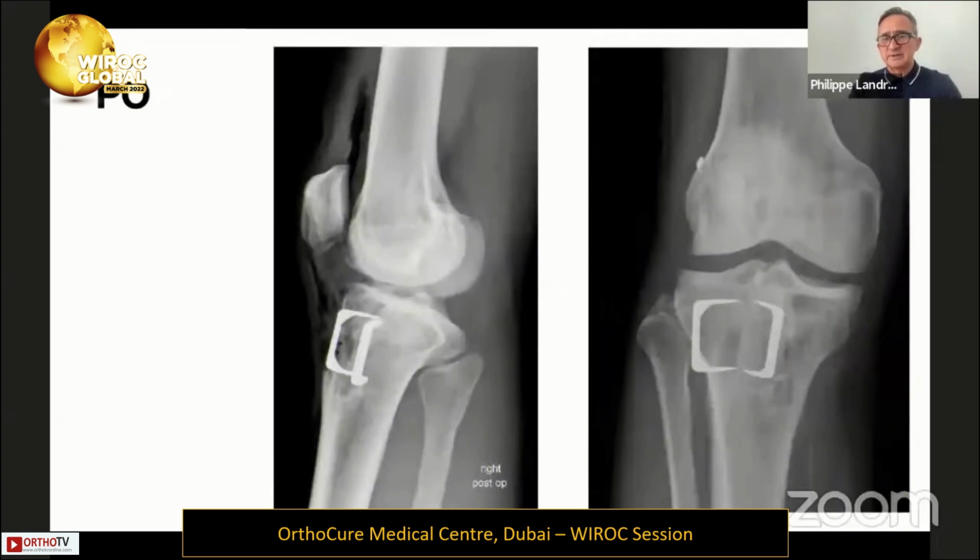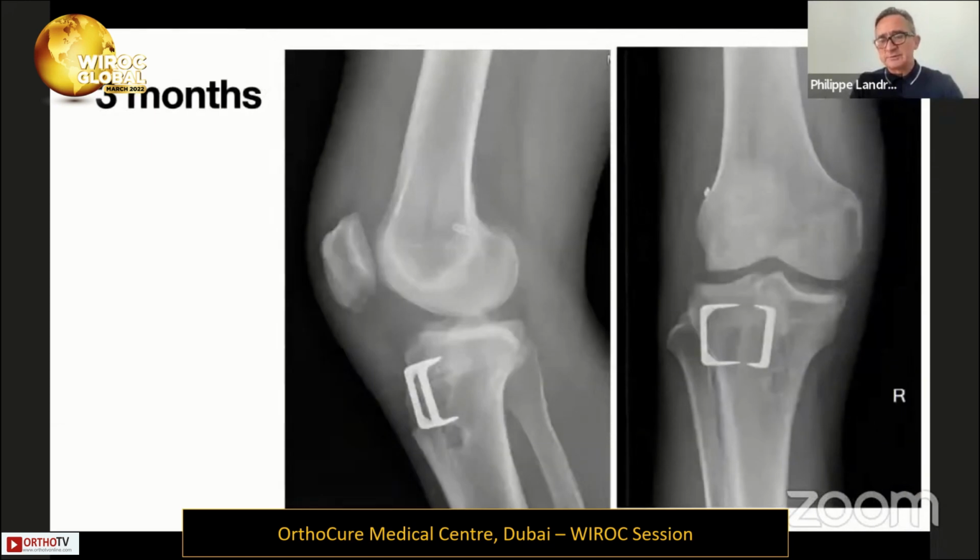This is a post-operative image of this deflection osteotomy, and this is the result at 3 months. The post-operative management is almost the same: partial weight bearing during the first 3 weeks, then progressively weight bearing, because it's a compression on the joint, on the osteotomy area. So no need for no weight bearing during 6 weeks. We can mobilize the knee as it comes without any real restriction. So in other words, a little bit like a normal ACL revision, but with a progressive return to weight bearing.